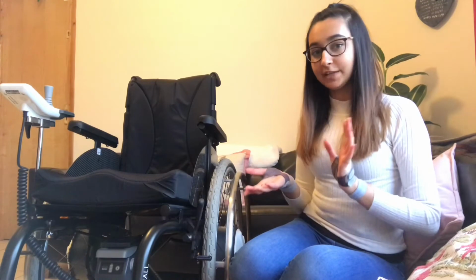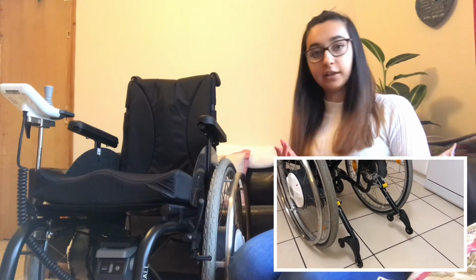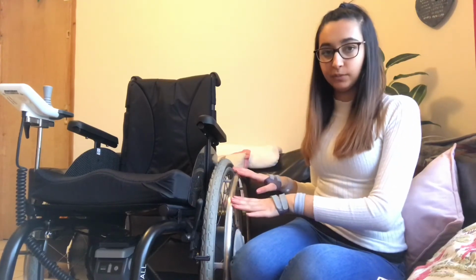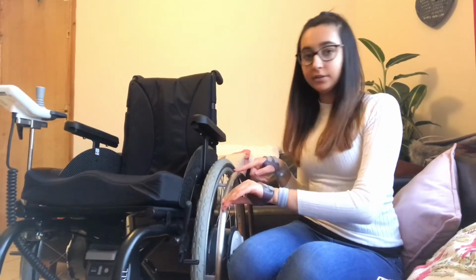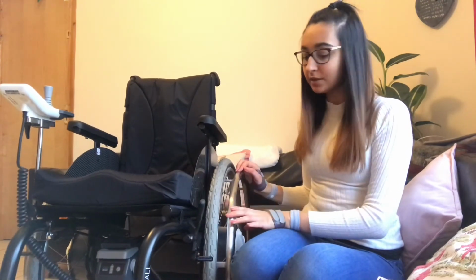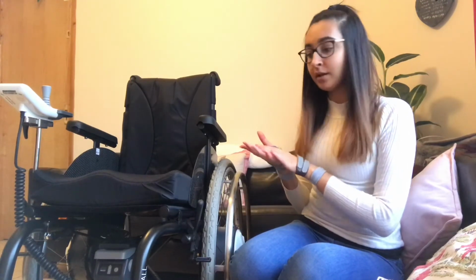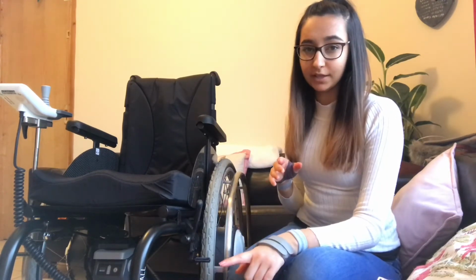And then as you can see from this photo, it has 2 anti-tippers on the back of the wheelchair, and they also double as wheel jacks, so they help you get the wheels off because the wheels on this chair are quite heavy, and the anti-tippers I would say are necessary. The wheelchair is a lot more tippy than I expected, so that's something to bear in mind. And if you are going to get the e-fix, which is the power assist, then I would say whatever wheelchair frame you get, to get bigger caster wheels. I forgot to say that last time.